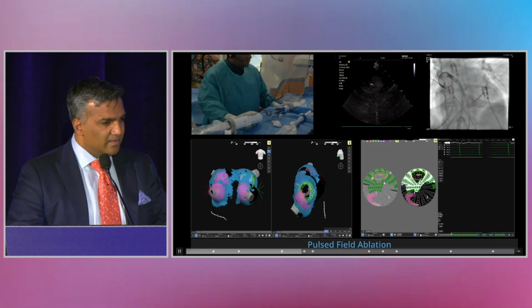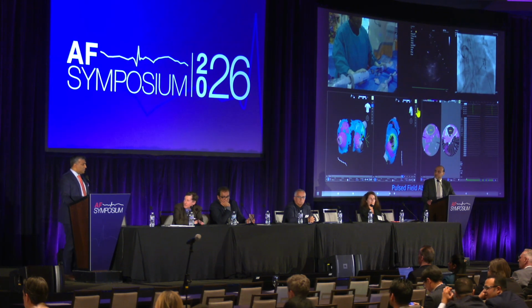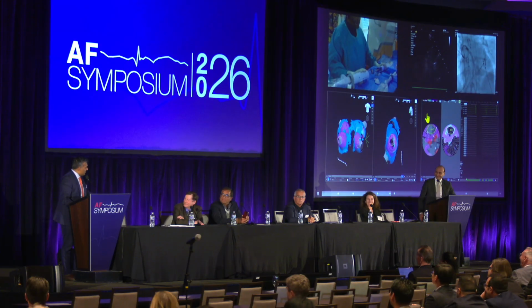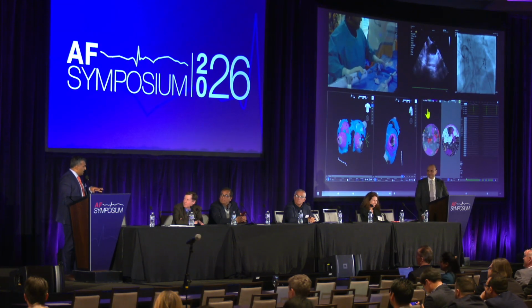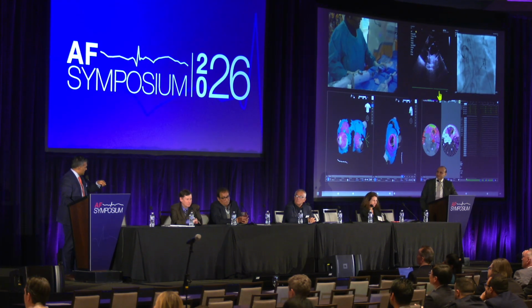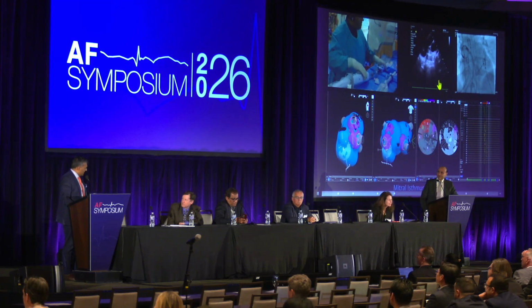It's pretty good. Do you want to comment, Vivek, on what this cannot do? Are there places you cannot get easily? You probably can't get in the coronary sinus very easily. I wouldn't put it in the ventricle very seriously. But having said that, we did put it in the right atrium, as I'm going to show you in just a second. Yep. So I think in the atria you can get pretty much all the areas we care about. Yeah.